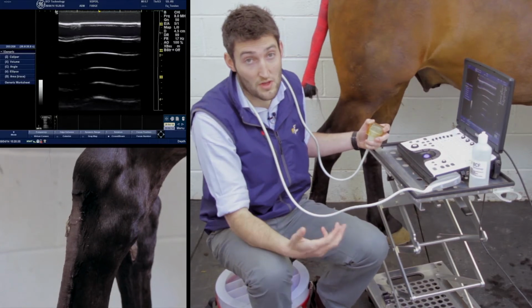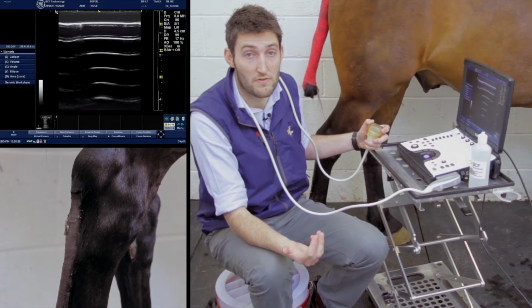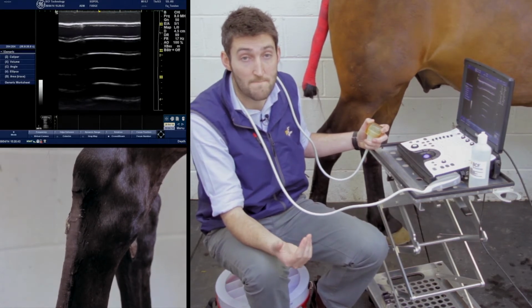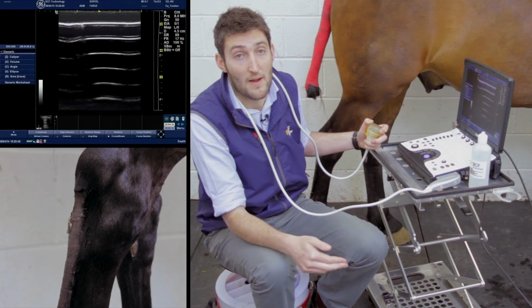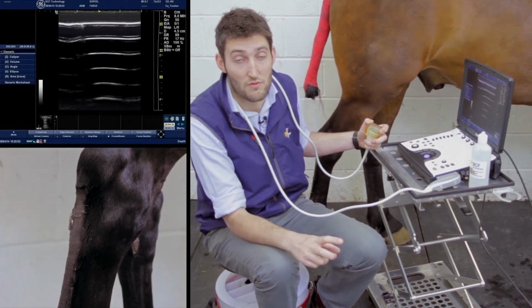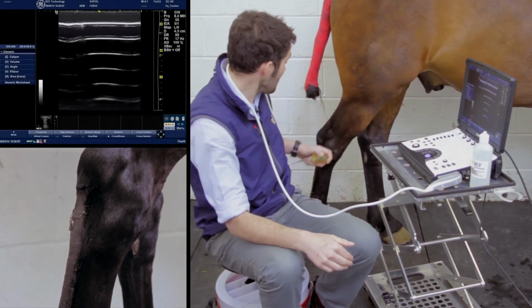In this video we're just going to scan the structures down the plantar aspect of the tarsus. We're starting just distal to the tuber calcanei, and then we're going to work down in 2 zones from the tuber calcanei to really the head of the splint bones. So that covers the tarsal region, and we split that into zone 1A and 1B.